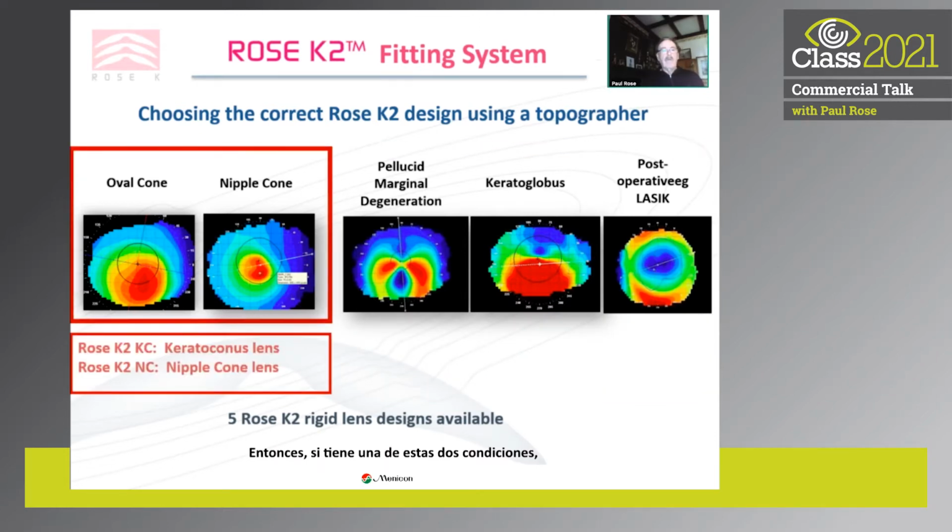So if you have one of these 2 conditions, either oval cone or nipple cone, you're going to use one of these two designs, either the keratoconus design, my original design, or the nipple cone design here.